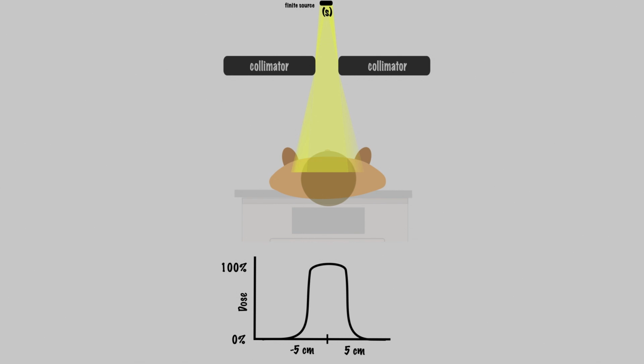You'll see that S projects down here through the edge of the collimator and diverges. If we set up the patient here, there's going to be some penumbra width W. If the source was small, as in our idealized scenario, the penumbra would be small. As we increase the size of our source, the penumbra increases.